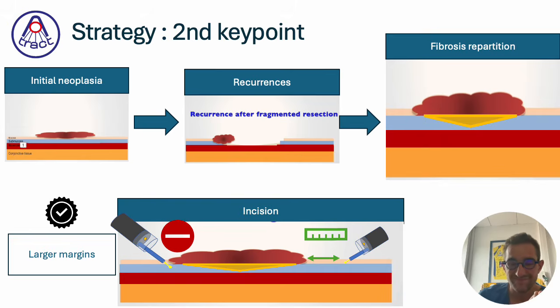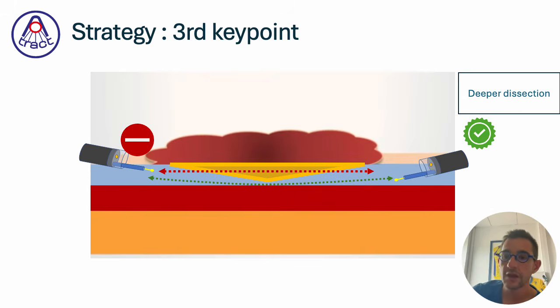So beginning very close to the lesion is probably really more challenging than going at least 4 or 5 millimeters above, far from the scar, in order to have normal mucosa and submucosa to enter into the submucosal space and to approach the fibrotic area once you are already in the submucosa, and not when you are incising or doing the incision to enter in this area.